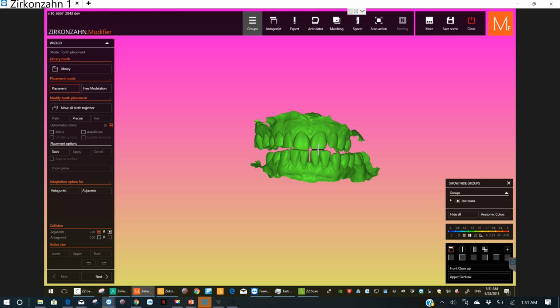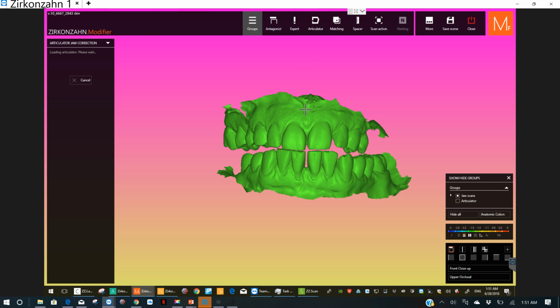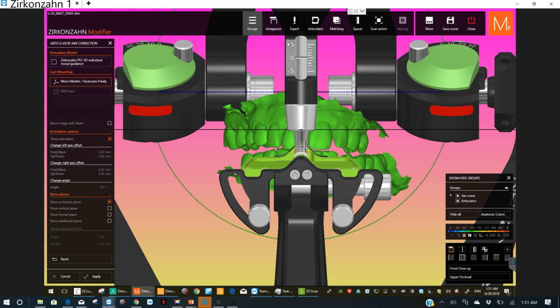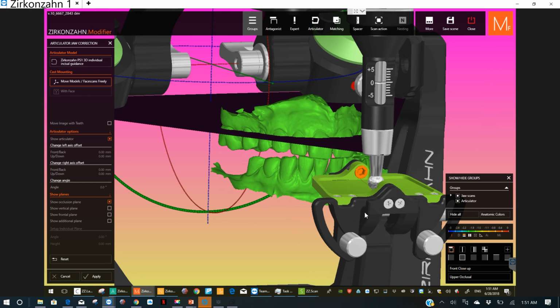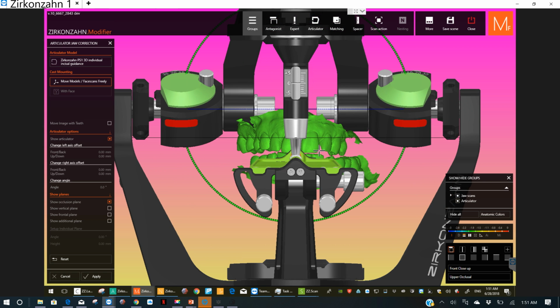Okay, so this is one of the most important parts of the whole thing, getting these lined up before you bring the teeth in. The teeth are very hard to rotate around, so get these things lined up first. So go to articulator, cast mounting, and be very picky with this part. I like to use these little things down here to make sure that we're always lined up perfectly.